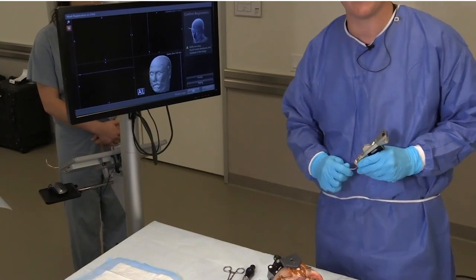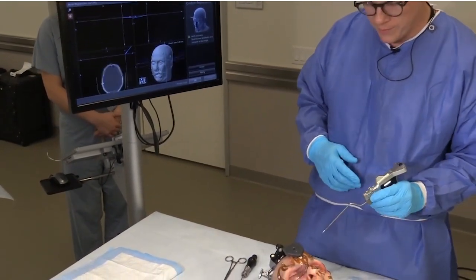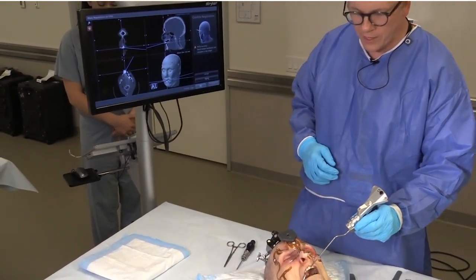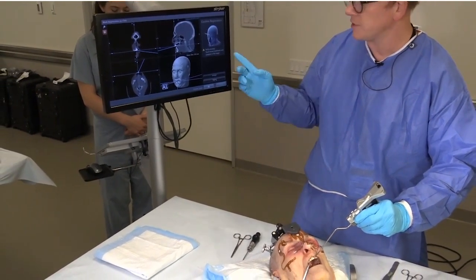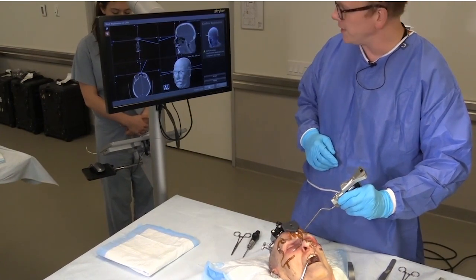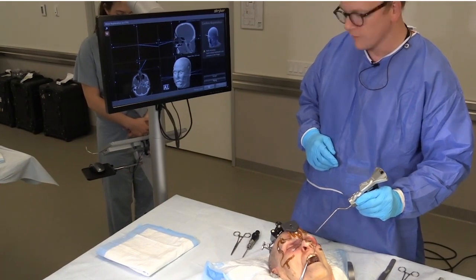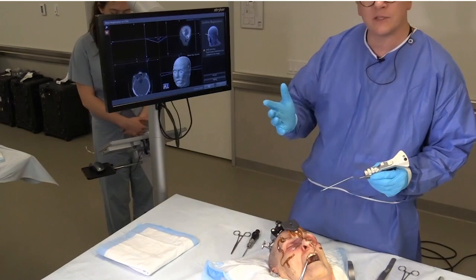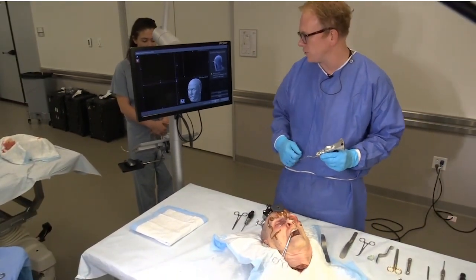Once you've completed the registration, you want to verify its accuracy. The easiest ways to do that are to touch some really solid points you know will be reliable — for example, the dentition. If I touch this on the upper teeth and it matches, that's a good reliable spot. The tip of the nose, the forehead, the canthi down on bone — any uninjured spot that's not going to move gives a good idea of accuracy. Skin is more susceptible to change and moves with pressure, so it's not as reliable for checking registration.